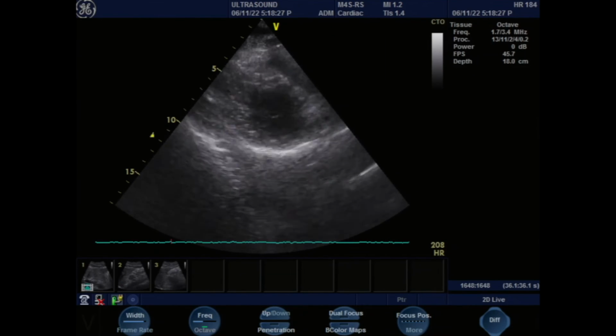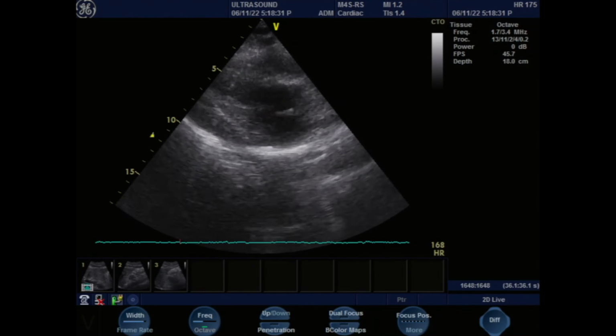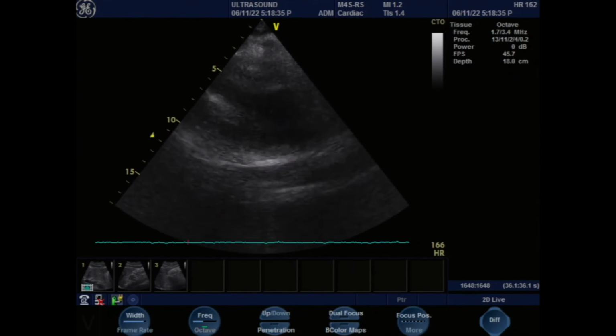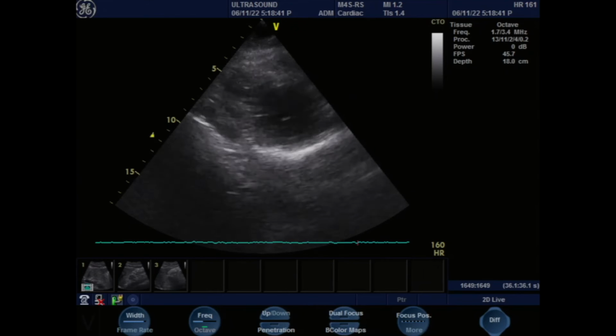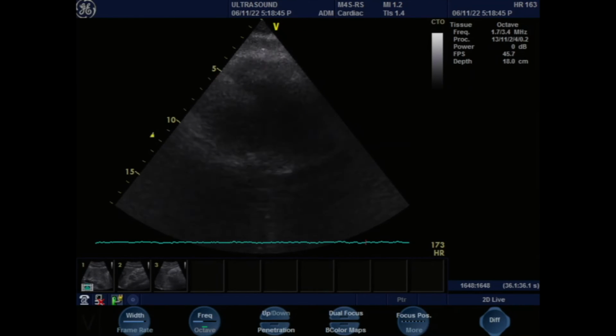5 minutes? Okay. Dr. Brahma, quick question. Would it be possible to see calcification on ultrasound? Not on ultrasound. If you're very lucky, sometimes you can see the take off of the RCA. And if it's a very calcified plaque, it might cause shadowing, but that's only the beginning of it. You can't see the rest.